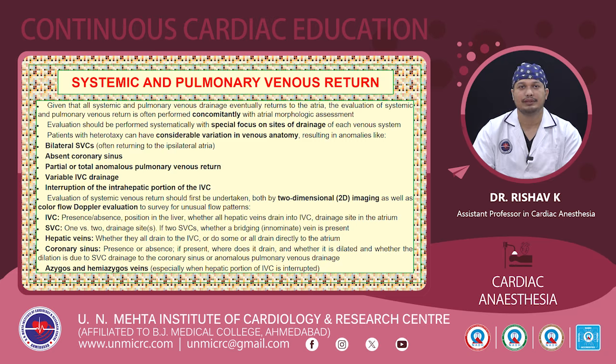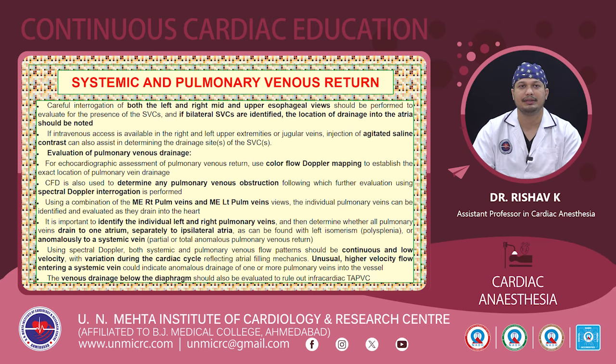Coming to hepatic veins, whether they all drain to IVC or do some or all of them drain directly to atrium. Coming to coronary sinus, presence or absence, if present, where it drains and whether it is dilated, and whether the dilation is due to SVC drainage to the coronary sinus or anomalous pulmonary venous drainage. Also, we may have to examine the azygos and hemiazygos veins. Usually the azygos and hemiazygos veins are a little bit difficult to evaluate using TEE, but where the hepatic portion of the IVC is interrupted, it is necessary to examine the azygos and the hemiazygos veins.